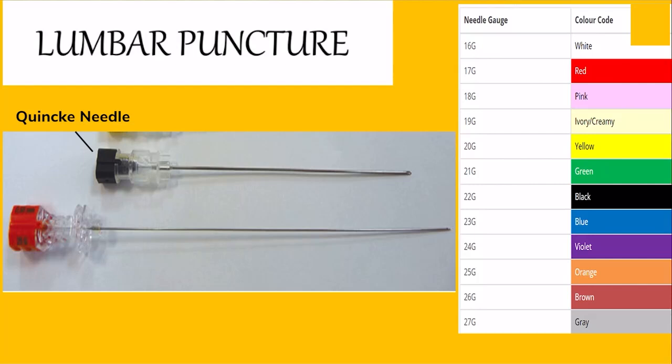The cutting edge of this is really sharp. Therefore, the chances of post-lumbar puncture headache would be relatively higher, and the length of this black hub Quincke's needle is 90 millimeter. However, in some cases, you might have to do repeated lumbar punctures as well.